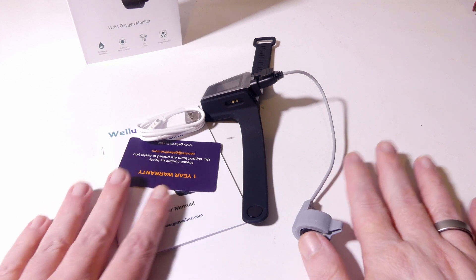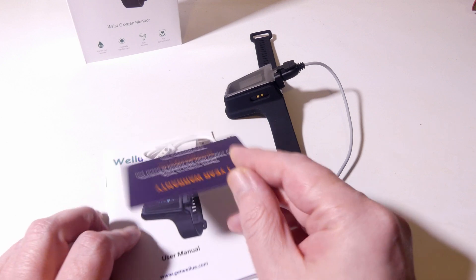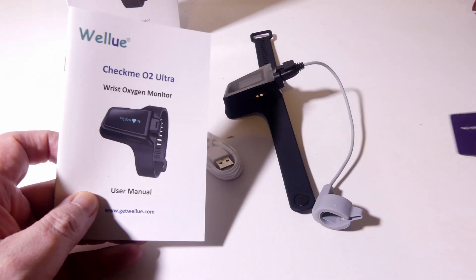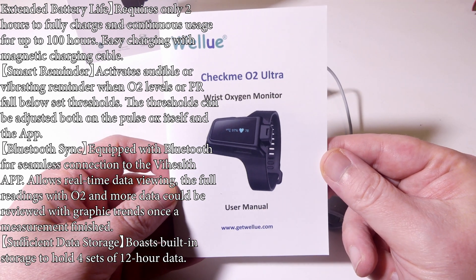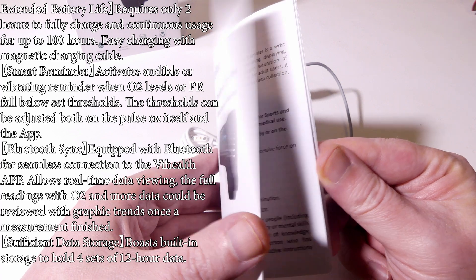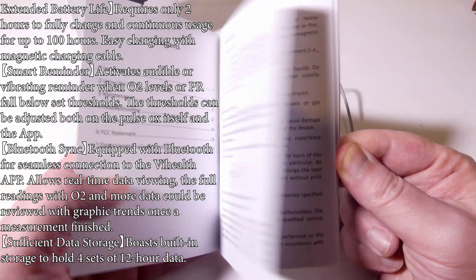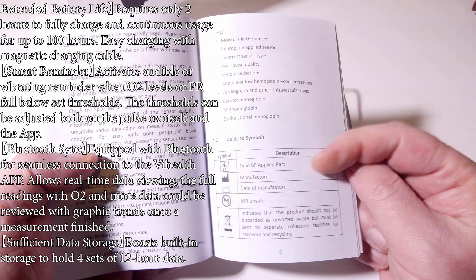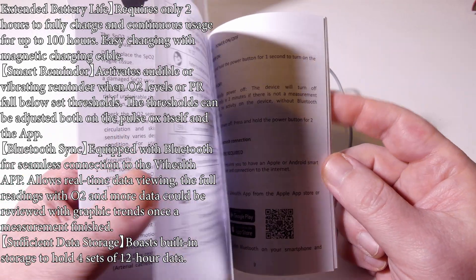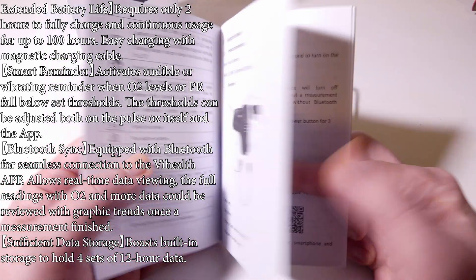This is everything that we get once we open the box. You do get a warranty card from WellU and also a user manual for the CheckMe O2 Ultra. This is written in English — it's not micro print. You're not going to need a magnifying glass to read this, so you will be able to navigate it very easily. It gives you a bunch of different setups, what comes in the box, what the buttons do, and things like that.